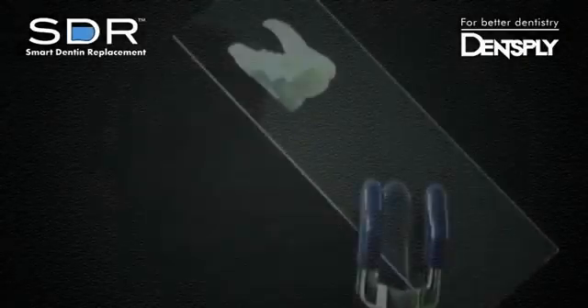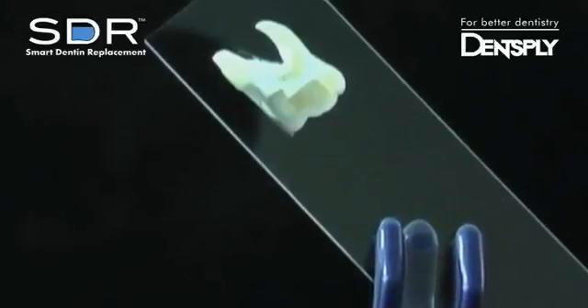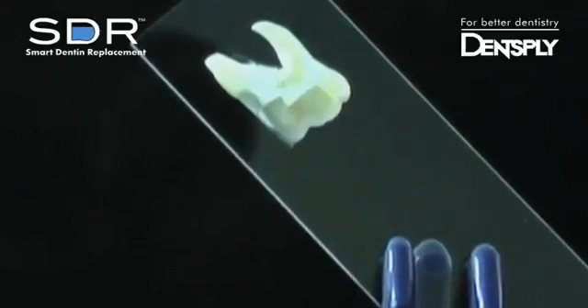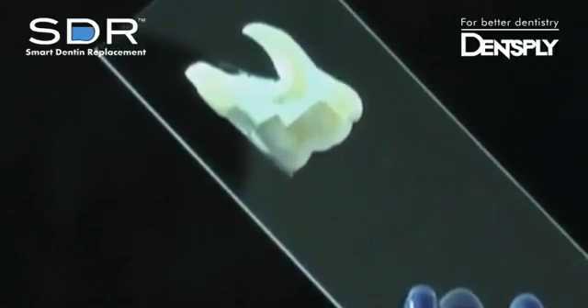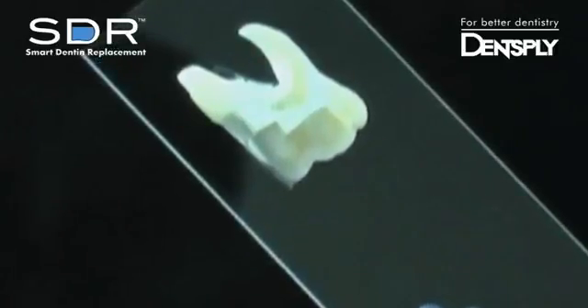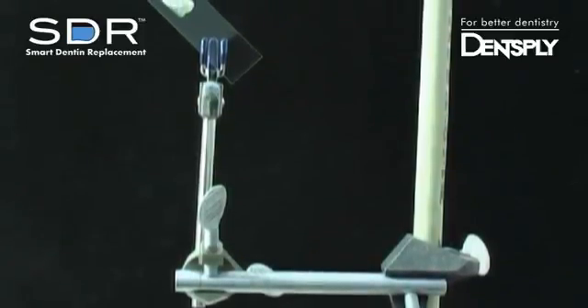Even when you're performing maxillary restorations — to demonstrate, a human molar was prepared for a large class 2 restoration. The tooth was cut in half and adhered to a standard glass slide. A matrix band was placed to seal the proximal box, and the glass slide was positioned at a 45 degree angle to mimic a maxillary restoration.